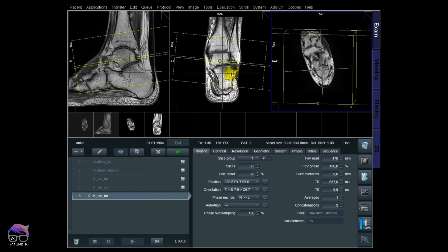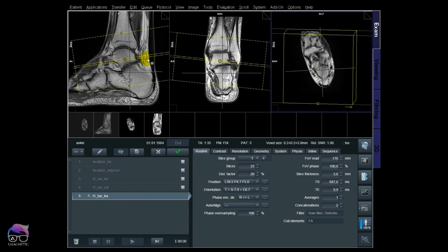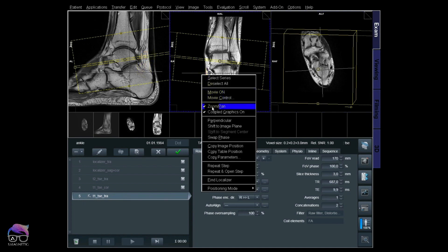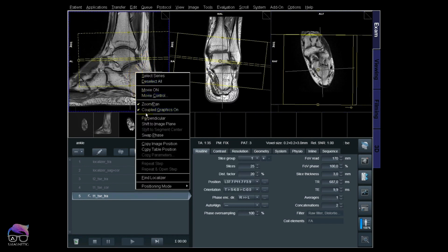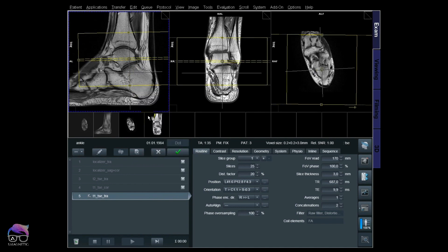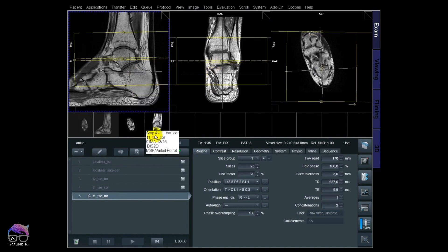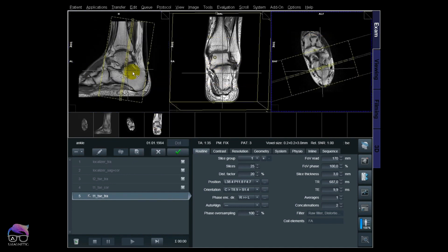You see the transversal line is right there. We leave the transversal window alone — do not activate that one. We're only going to use sagittal and coronal for the perpendicular tool. This saves a lot of angulation time when using the perpendicular tool.